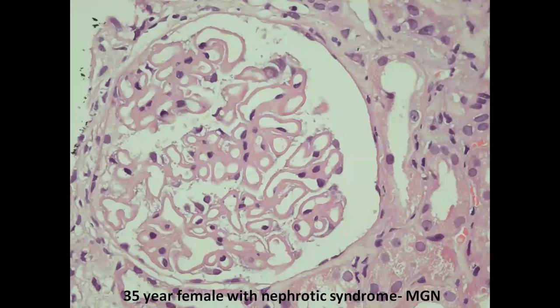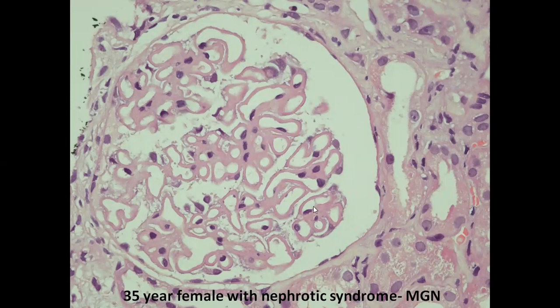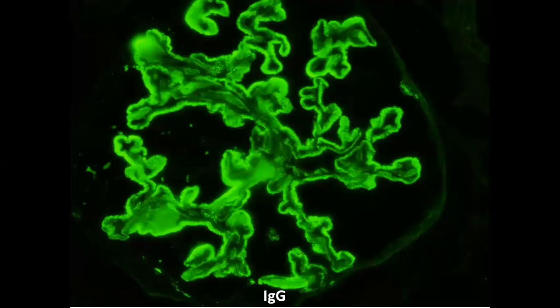So this was a 35-year-old female with nephrotic syndrome. There was uniform membrane thickening, with lifting up of podocytes. IgG was granular, so you can see the granularity here. You can see these kind of granular deposits along the capillary loop. Occasionally, when you look at the immunofluorescence, because it is a 3-dimensional loop, at places it will appear that in the mesangium also some staining is there. The best localization of deposits, whether they are in the mesangium or along the glomerular capillary loop, can be done only ultrastructurally, on electron microscopic examination.